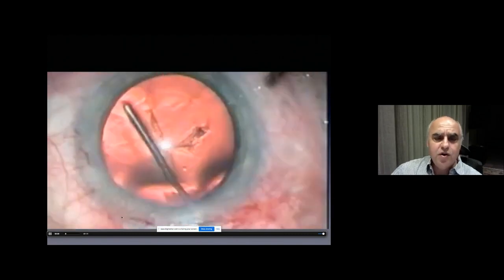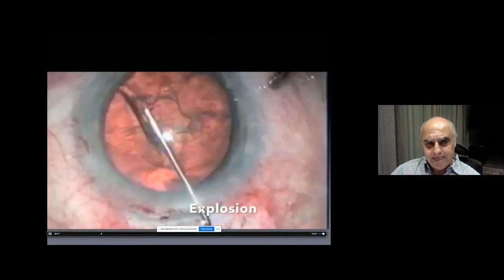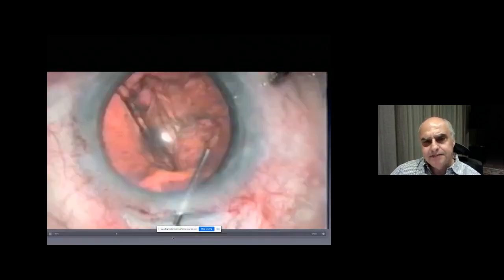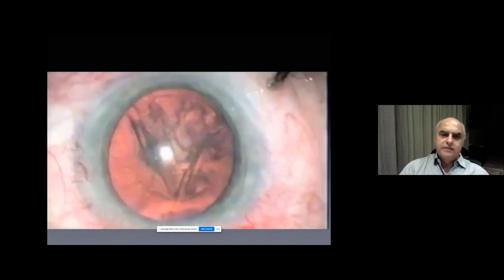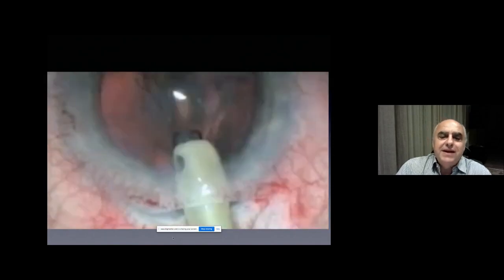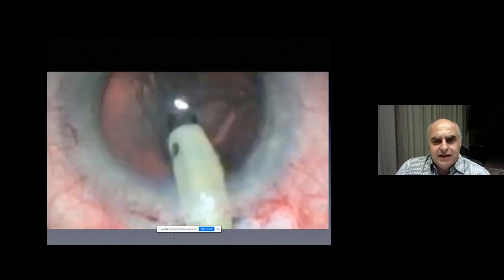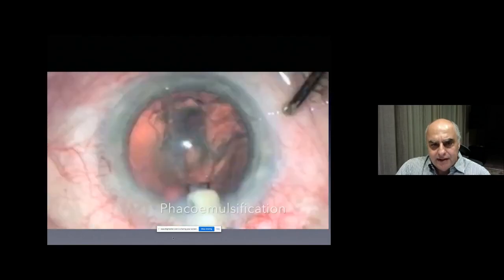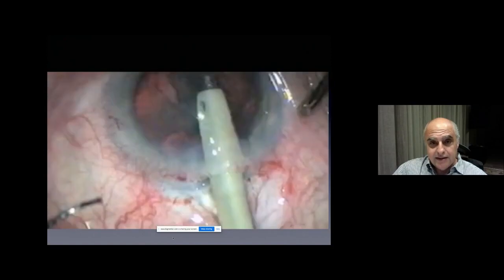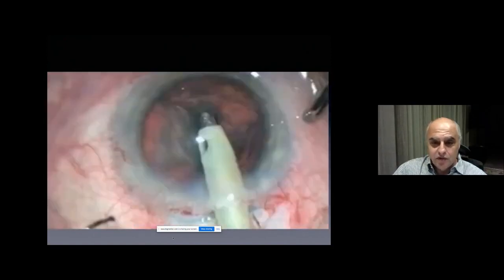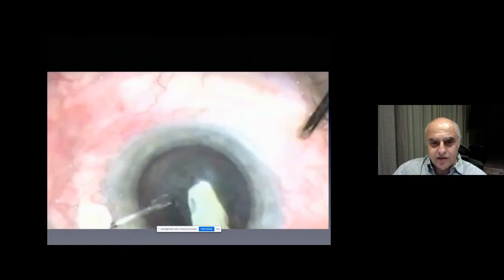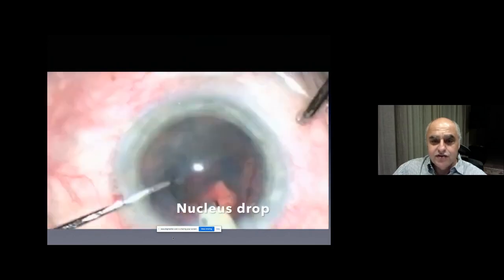But the most serious problem — look here, just watch. This is a simple case. Hydrodissection, and now phaco emulsification. It looks like a simple, straightforward case — it looks like nothing happened. The lens is not moving properly. Now the step of cracking the nucleus. And now the nucleus is into the vitreous.